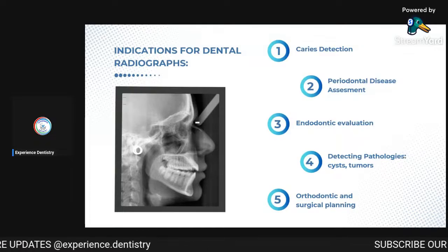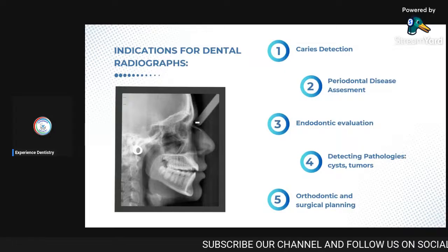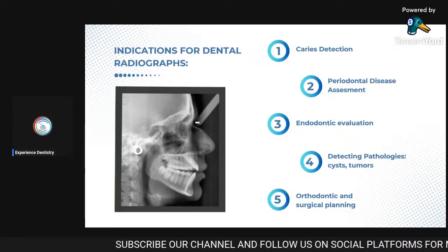Okay, thank you. Basically, it is involved in detecting the need for orthodontic treatment, and for treatment planning as well.